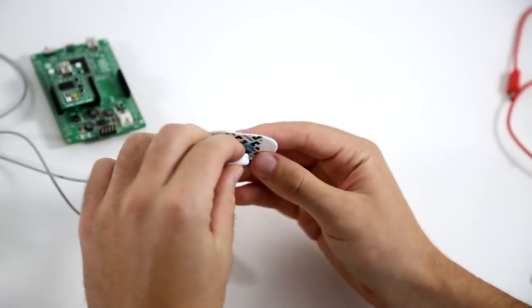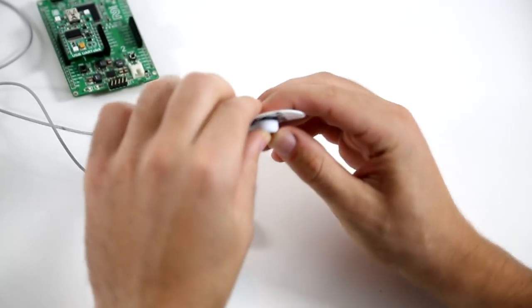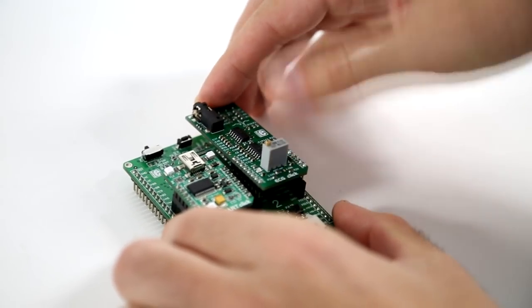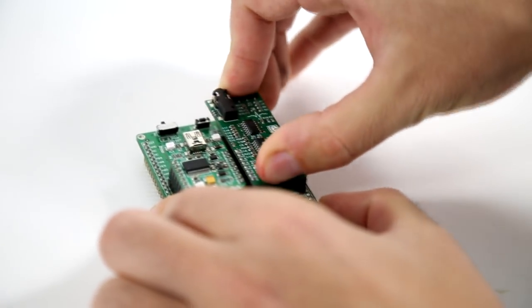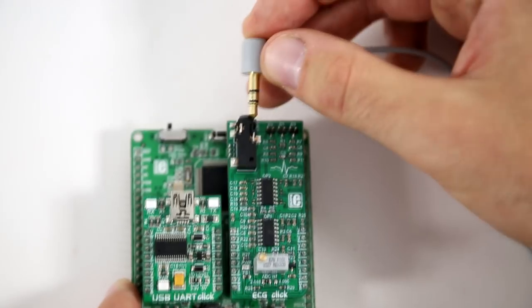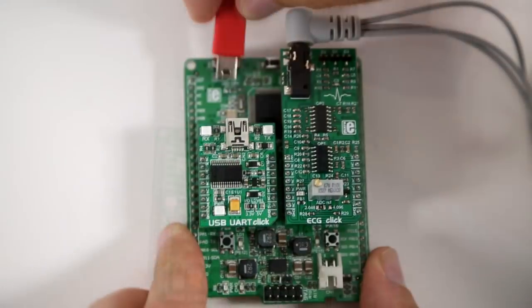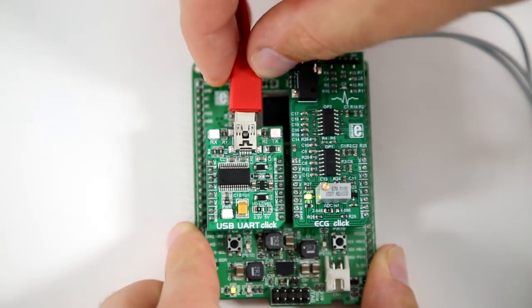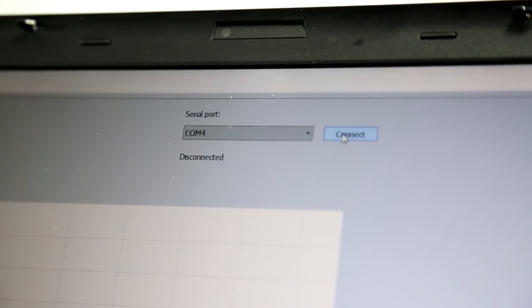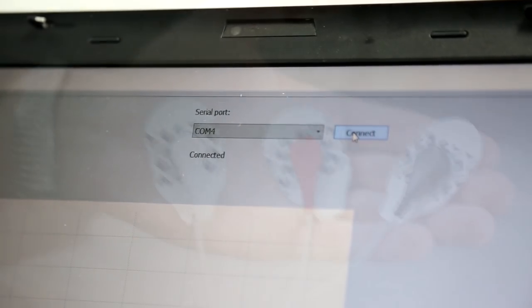First, take the electrodes and connect them to the cable. Then plug the click onto the microbus socket. Take the cable and plug the 3.5mm jack into the appropriate socket. Then connect the USB UART terminal to your PC, launch the microplot application, and connect it.